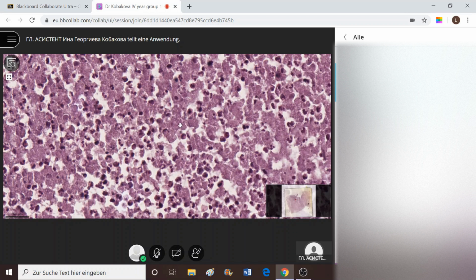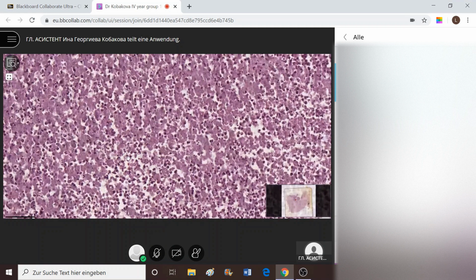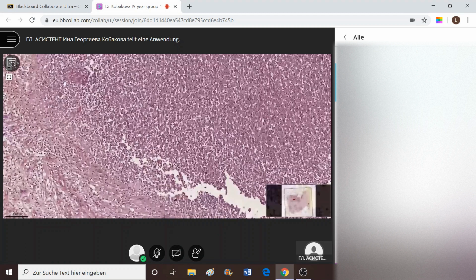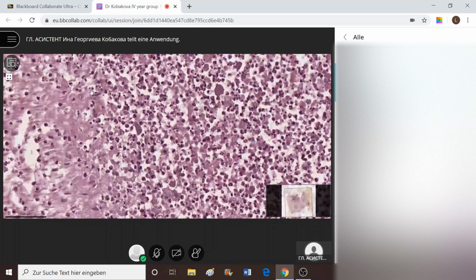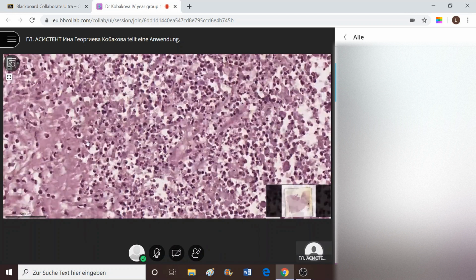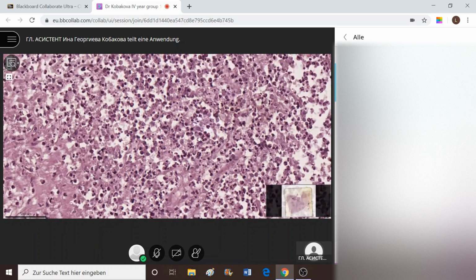their lysosomal enzymes and they have lysed all of this structure, along with foamy macrophages, which majorly should be positioned next to the membrane of the abscess here. There you go, foamy one again. One more here, one more here, one more here. And a predominant population of leukocytes, which appear to be with segmented nuclei. You can recognize them really clearly.